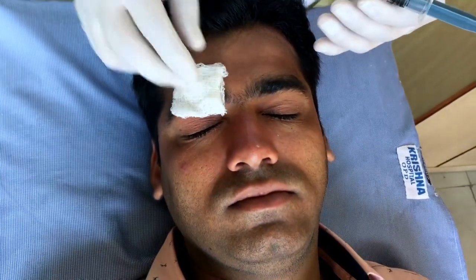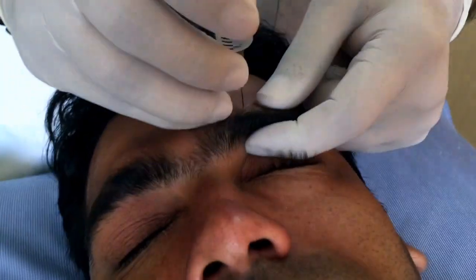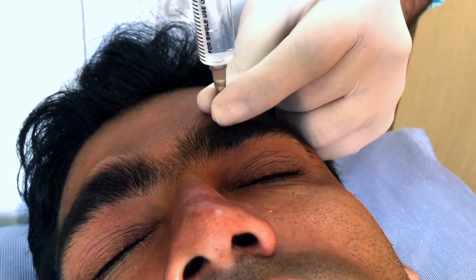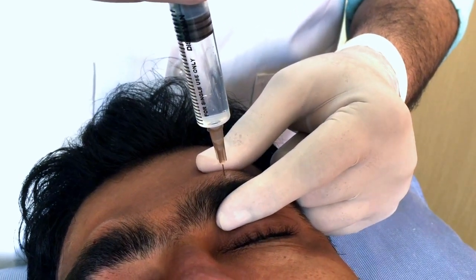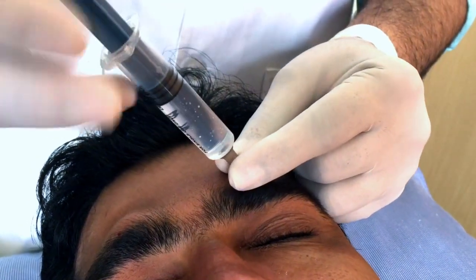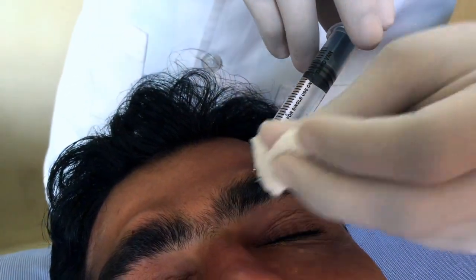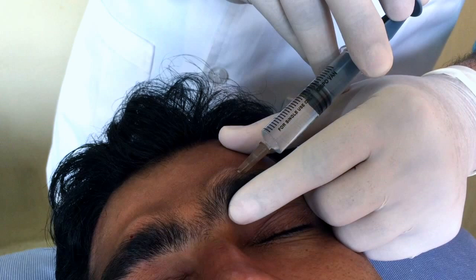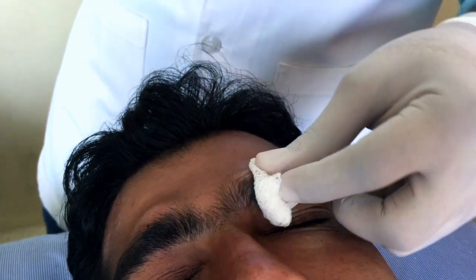Similarly, on the other side. Palpating the notch, 1 cm above the eyebrows. Try not to go towards the eyelids or too far below, because there is a chance the anesthesia goes down into the eyelids and causes swelling, which the patient doesn't desire. Aspirate and inject half a cc — you'll see an elevation. Go in laterally, aspirate, half a cc more. Then medially from the same point, aspirate and inject. Gently massage.